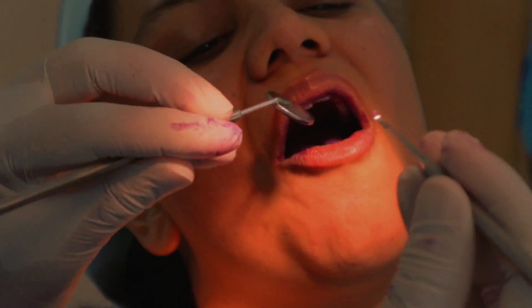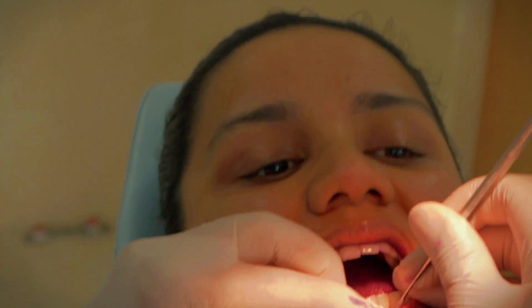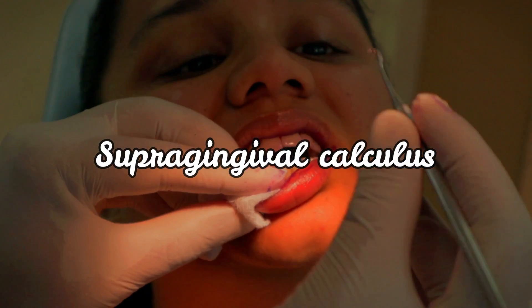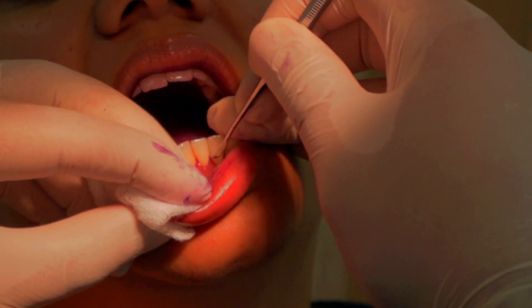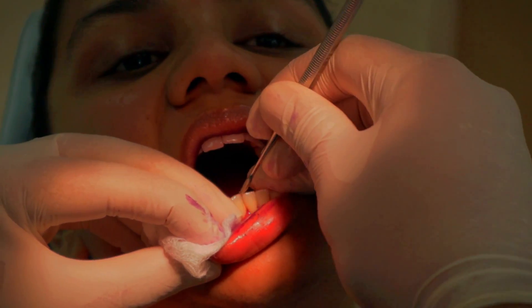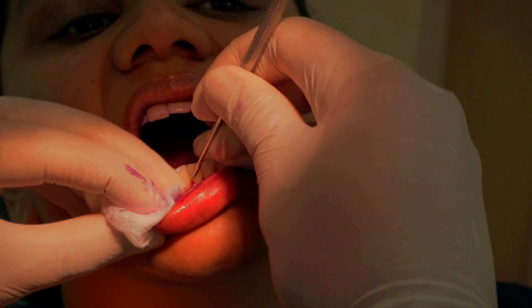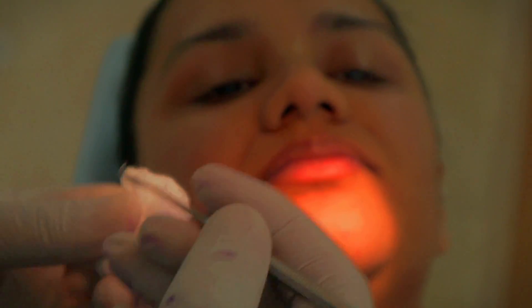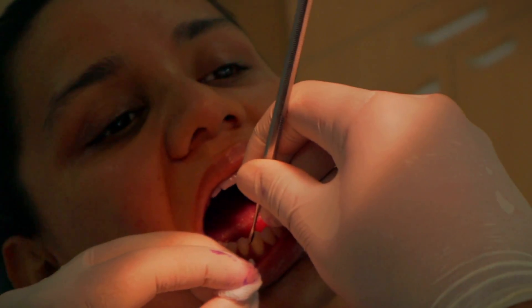I began the scaling of her teeth. One thing I recommend at this step is to use a gauze so you can pull back the lip, so it's not as slippy. There are a few things to take note of at this stage. The sickle scaler is only used for supra-gingival calculus, which is above the gingiva. So if the calculus is deeper inside the gingiva, we need to consider using a different instrument. The grasp used for the sickle scaler is called a pen grasp. This is when the thumb, index finger, and middle finger are used to hold the instrument and the ring finger is used as a fulcrum about which the movement of the scaler occurs. The whole purpose of this motion and position of the hand is to prevent carpal tunnel syndrome and to prevent pain in our hand and arm.